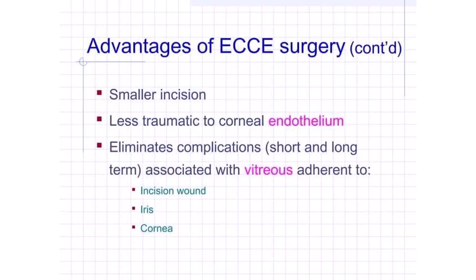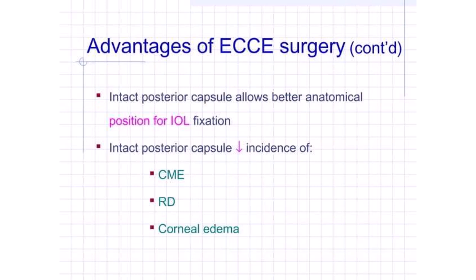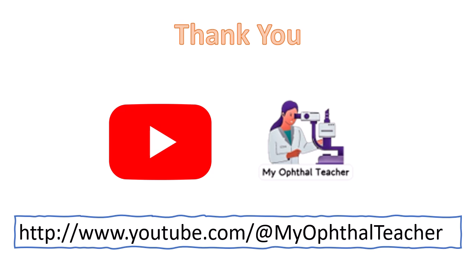The advantages of ECCE were that the incision was much smaller, it was less traumatic to the corneal endothelium, and it eliminated complications of ICCE. An intact posterior capsule allowed better anatomical placement of IOL and reduced the incidence of cystoid macular edema, detachment, and corneal edema. So in the subsequent classes, we'll be discussing extracapsular cataract extraction. And this was all about ICCE.